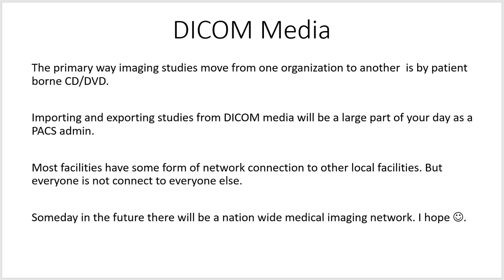DICOM media, one of my most hated things as working as a PACS admin. The primary way imaging studies move from one organization to another is by patient-borne CD or DVD. So stop and think about this for a minute.